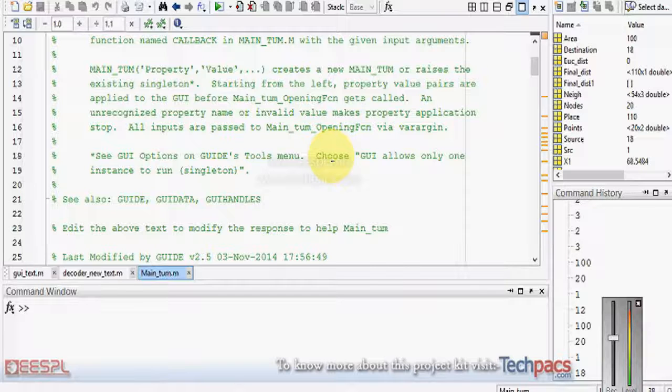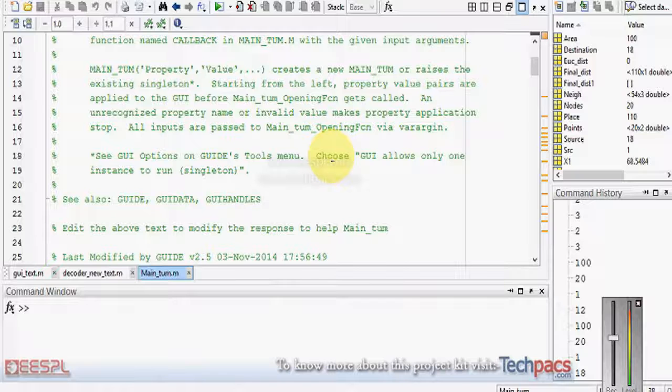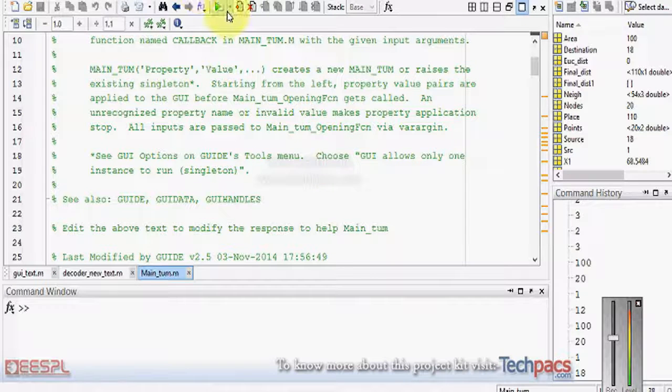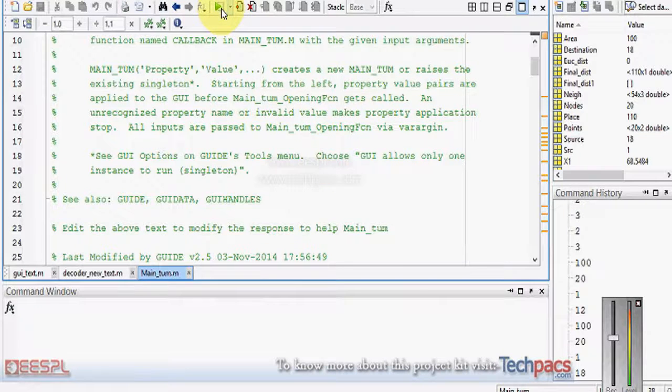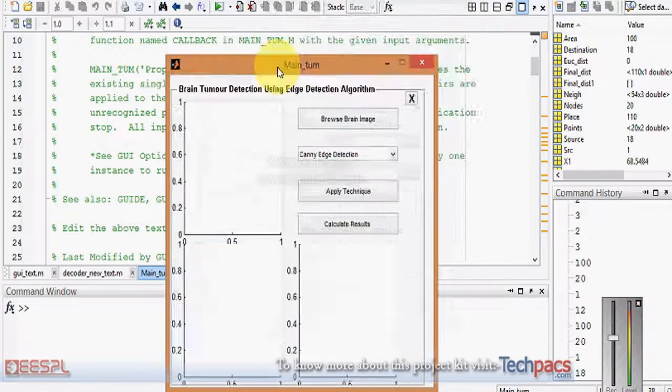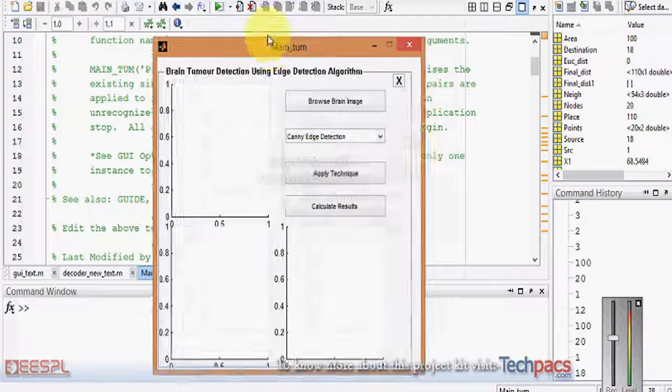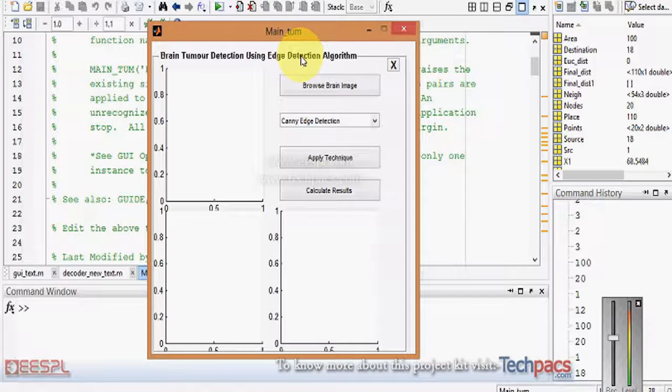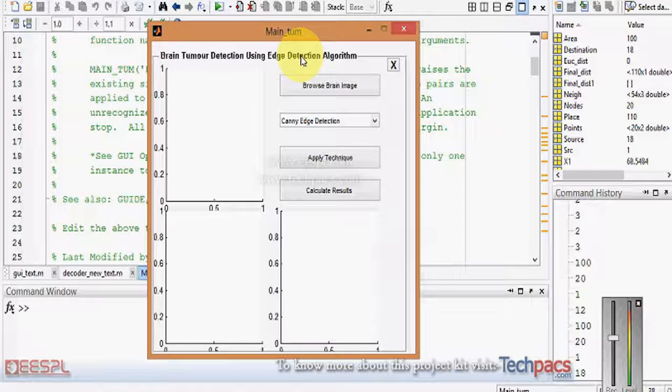By using digital image processing we can help medical persons in many manners. Today we are demonstrating a project on brain tumor detection using edge detection algorithms. This is basically a software in which you can browse an image on which you want to work.